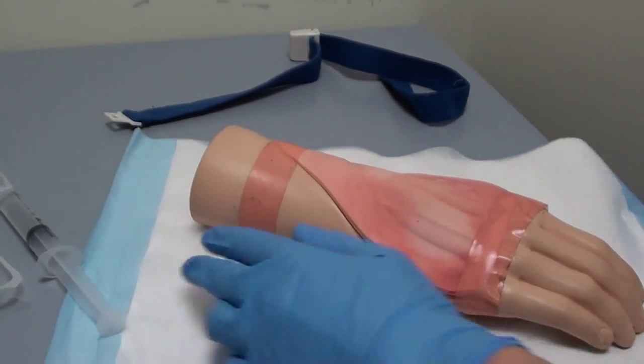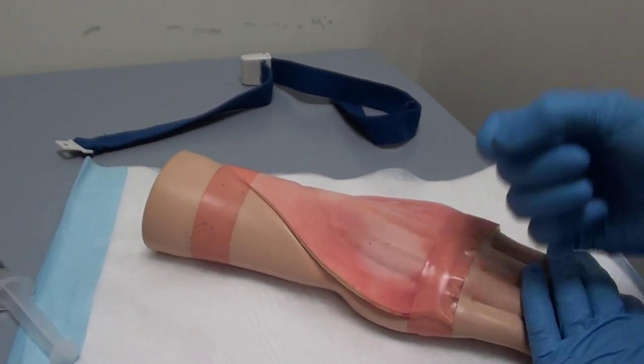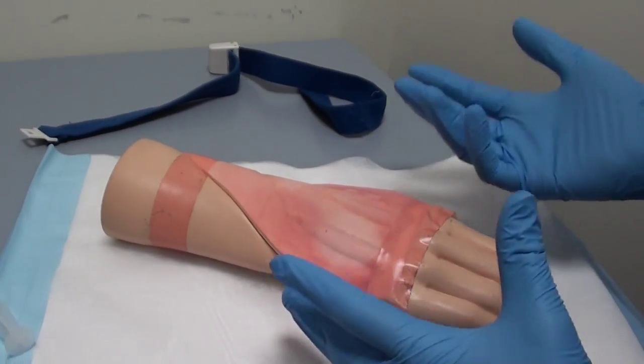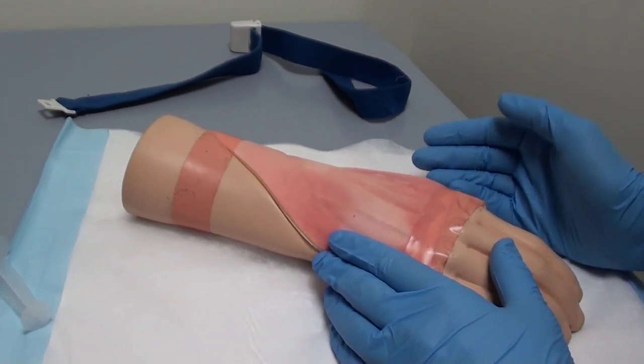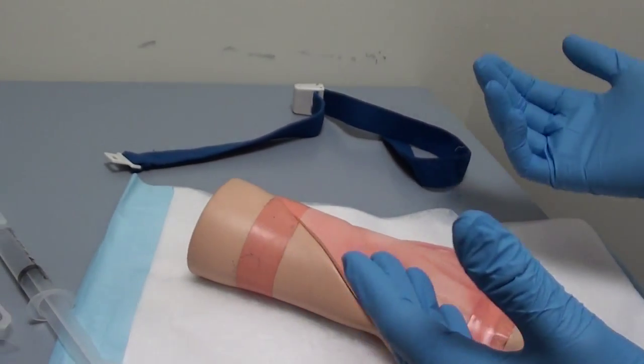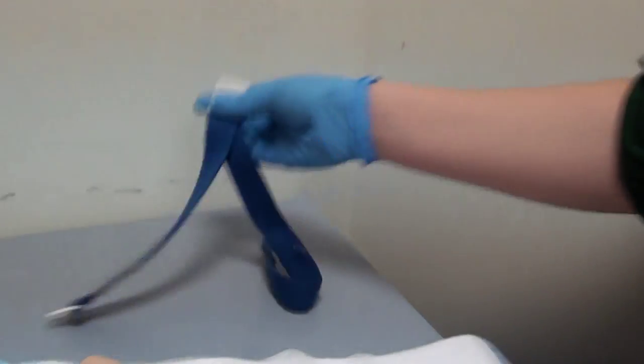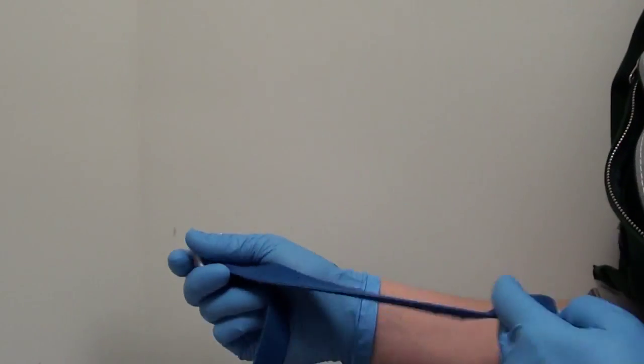Just going to get consent from the patient. I want to put the needle into your vein so then I can give you some pain relief. It will hurt you a little bit but it will help you much more in the long run. Assuming I've got the patient's consent, I'm going to go ahead. So now I'm going to put this tourniquet on.